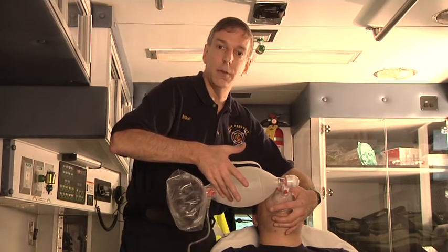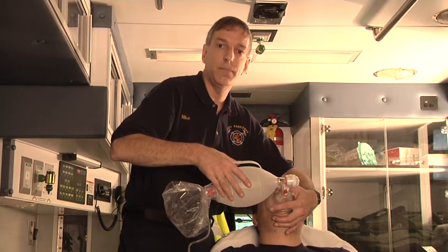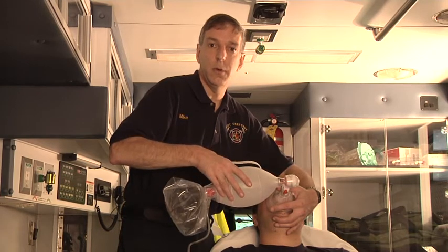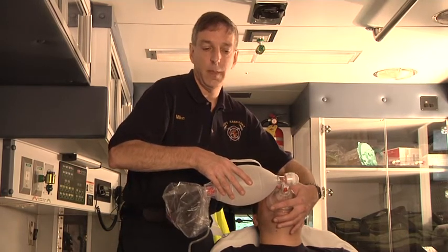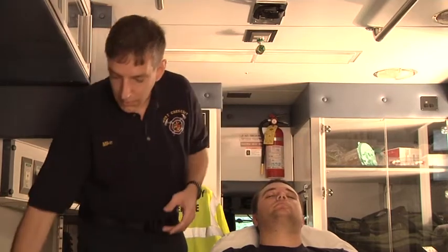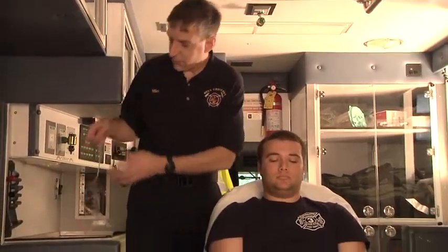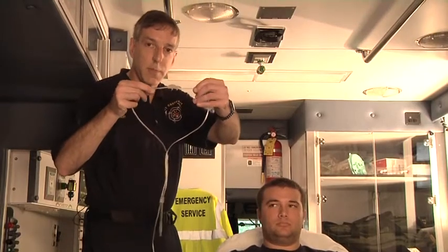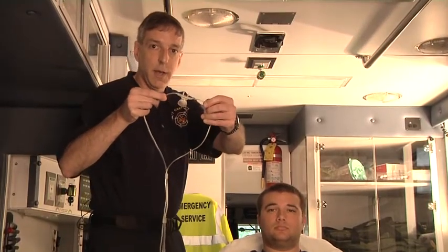Monitoring this can be somewhat tricky. We talked in another episode about using capnography. The capnography can be used through a nasal device that actually sits over the patient's face and measures the exhaled carbon dioxide.